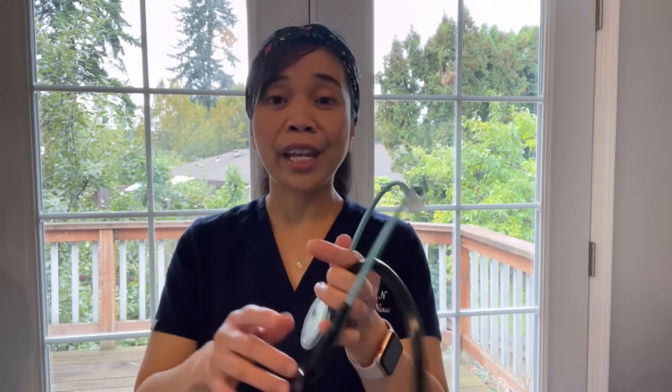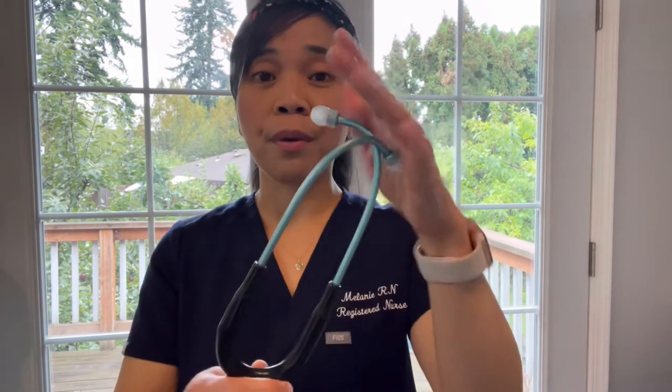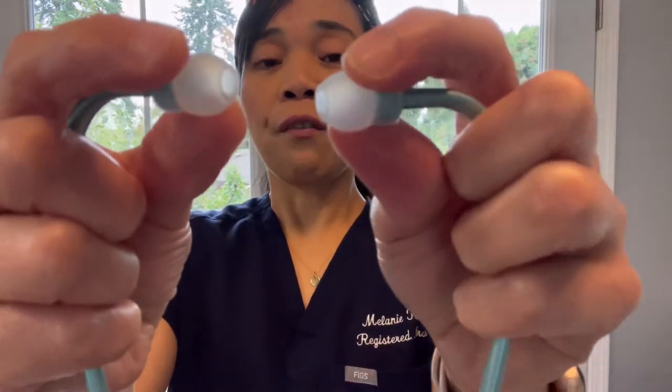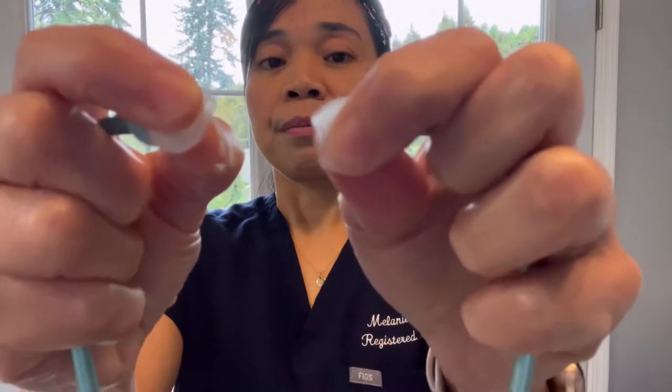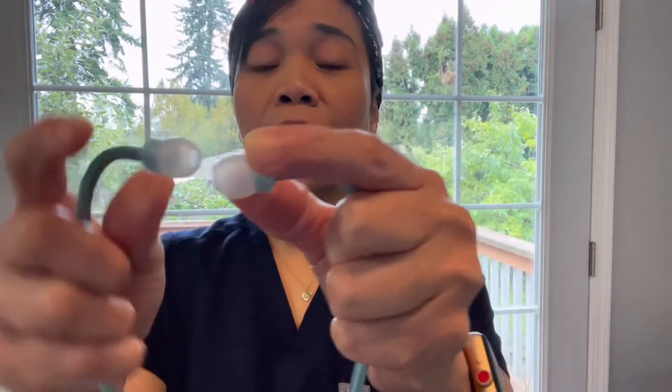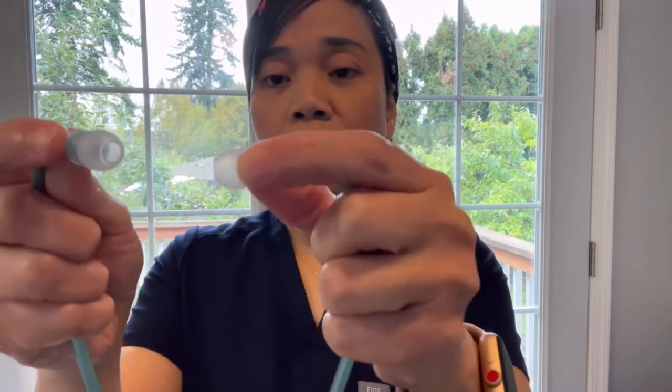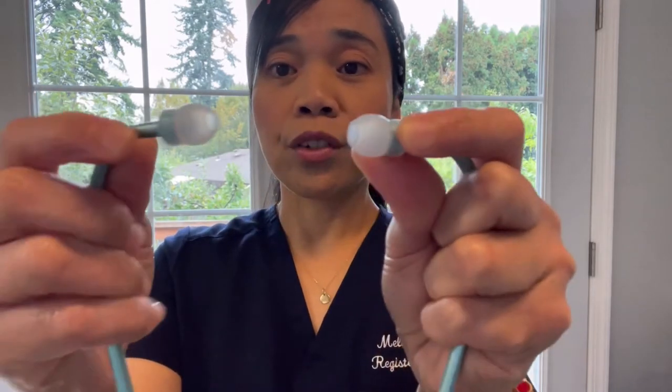Now I will show you the parts of this stethoscope and I will start from the top and show you the eartips right here. They are very soft and comfortable inside your ears. They are replaceable and removable, and it comes with three different sizes: small, medium, and large, all included with your purchase. So far, I haven't seen any wear and tear on this part, which I'm happy about.